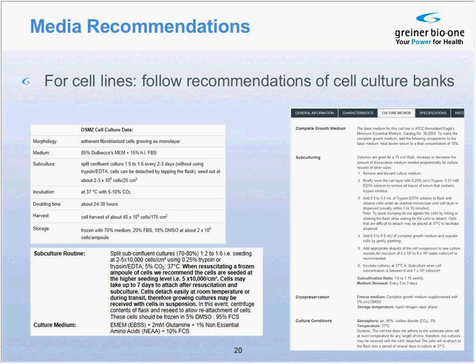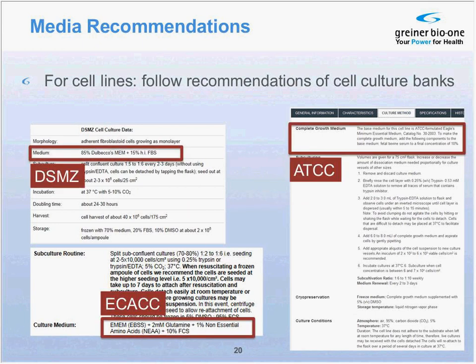While it might be alluring to feed a new cell line with medium that's just around in the lab, another choice is to stick to the recommendations of the aforementioned cell culture banks. By typing the name of the cell line into the search window of the cell bank website, all relevant information appears within seconds. They are not only on the media, but also on doubling time, subcultivation ratios, and general background information.